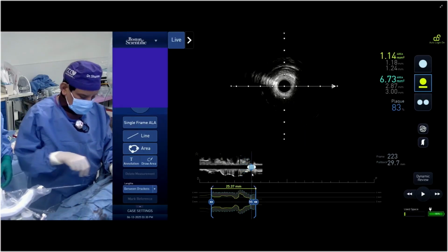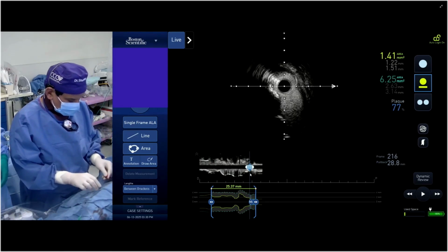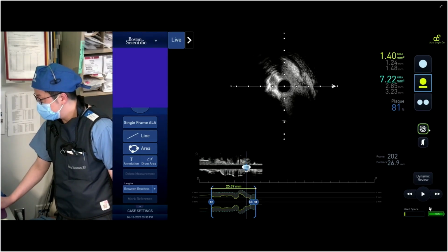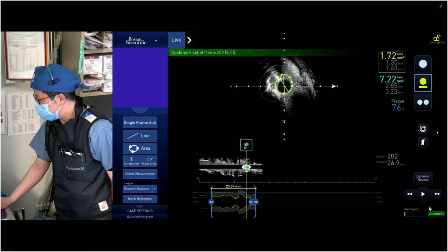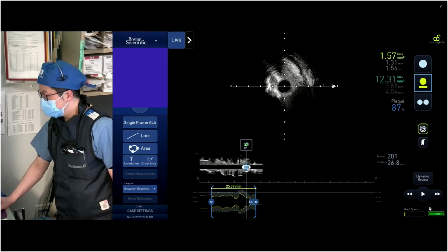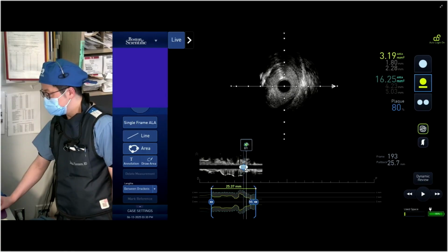2.9. Then the GuideLiner is engaged, so we don't see the left main with this tool. But we saw the ostial circ, and there's a circular calcium or how? Eccentric calcified nodule, ostial circ. And the other half is plaque free. Like 6 to 10 o'clock is the calcified nodule. High pressure balloon first, always.